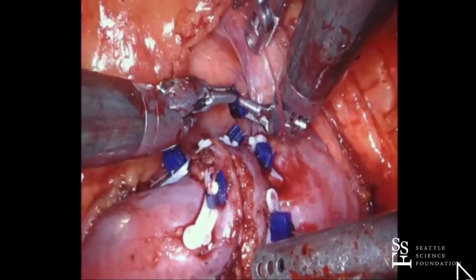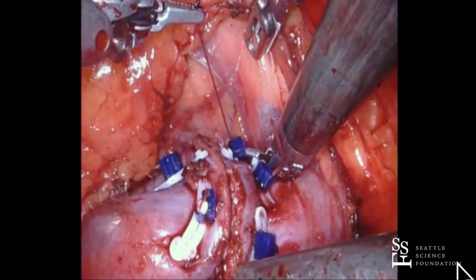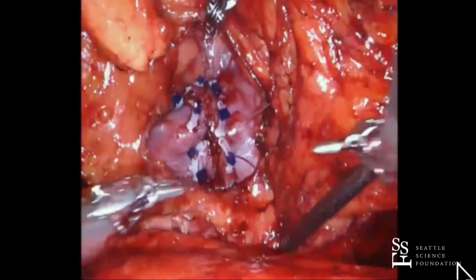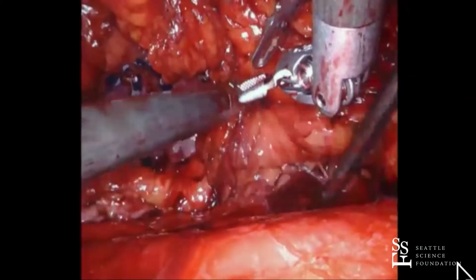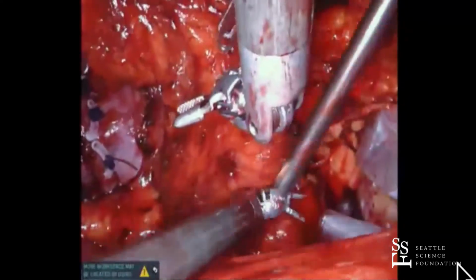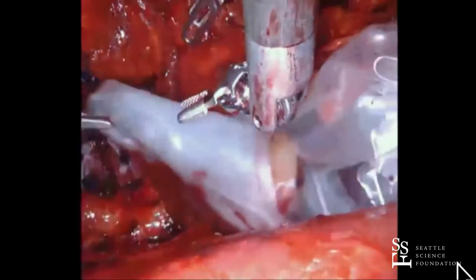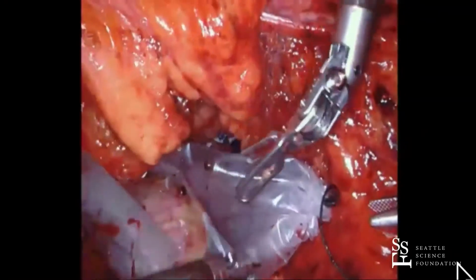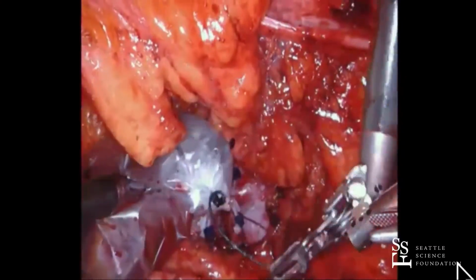So again, for research purposes, if you're in an academic center where you're measuring every percent of kidney that you're saving and you're doing renal scans before and after, then I think every nephron counts. But for me, being the guy in the trenches, in community practice, just trying to get good outcomes for the patients, I really am not concentrating that much on every last nephron in terms of the margin or how hard I crank on the stitches. But again, each person, do what you think is best.